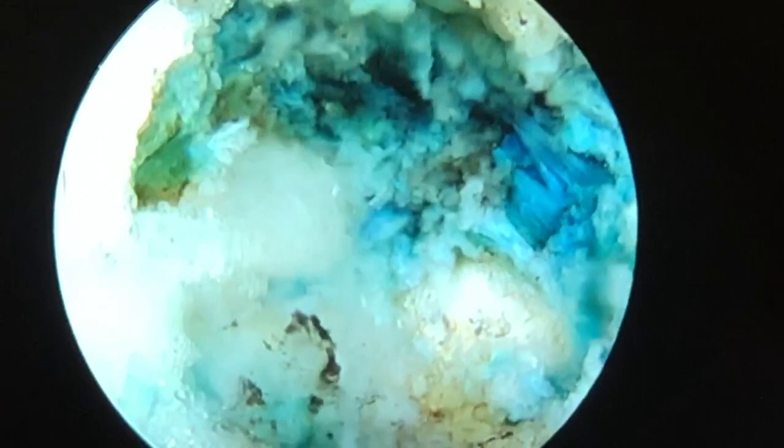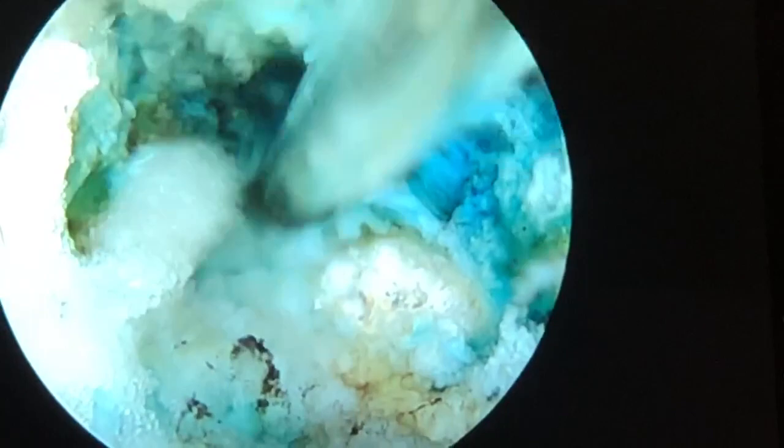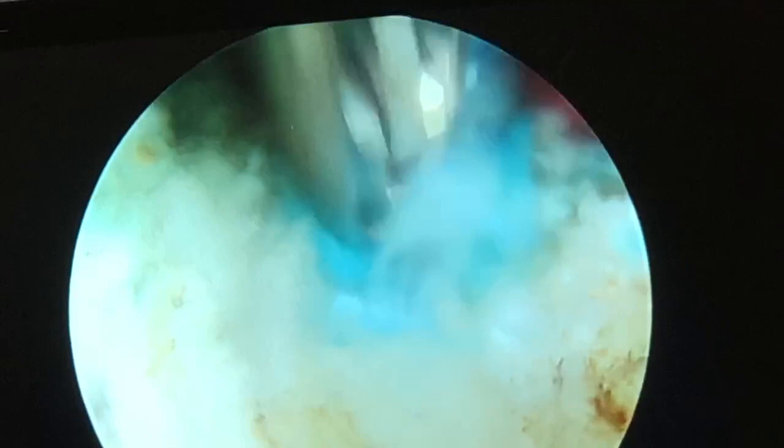You can feel around and tell — first of all, this disc is way too bouncy and incompetent; it's supposed to be really firm. There's a hole right there, that's probably where the annular tear is, and there's probably a bunch of fragments trapped inside, so I'm going to start reaching in there and grabbing stuff. You can just feel the loose pieces in here. I rely a lot on our neuromonitoring physician, who tells me when there's neural activity — we're also looking at his glutes for any spontaneous firing. It feels really good; I also use X-ray to check how far across I am.